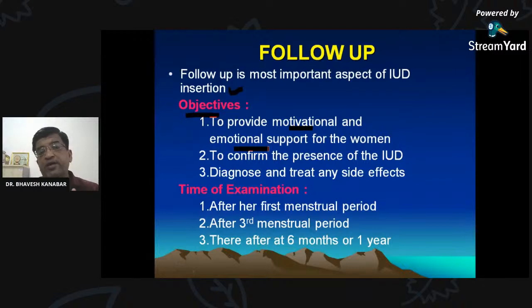As you know, we have inserted a foreign body inside the woman's uterus. So we need to motivate continuously, as well as give emotional support to the women, because there may be some issues related to this foreign body insertion initially, but over a period of time, with continuous emotional support as well as continuous counseling, these issues may go away. As well, initially, we need to confirm the presence of the IUD.